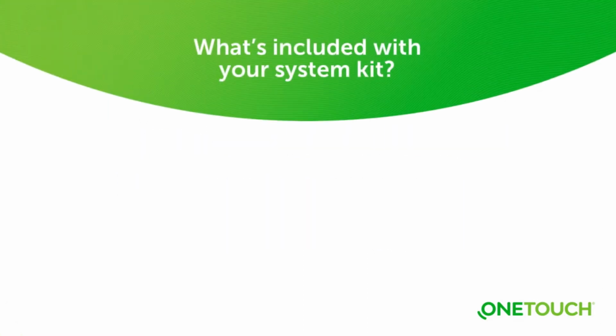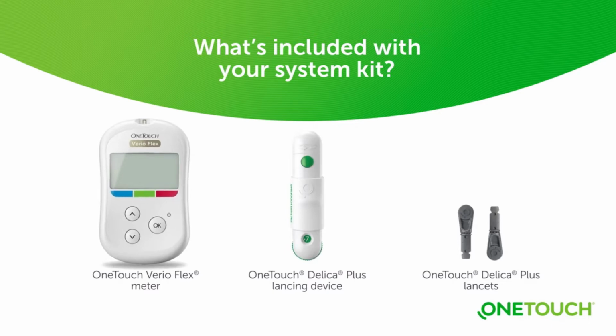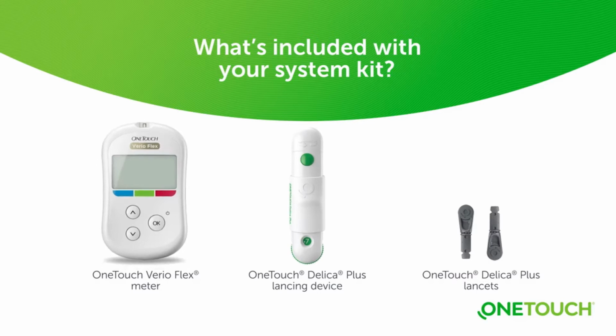First, let's make sure we have everything we need to begin testing. In your OneTouch Verio Flex system kit, there is the meter itself, a OneTouch Delica Plus lancing device, and a packet of OneTouch Delica Plus sterile lancets. OneTouch Verio test strips are required, but may not be included in your kit. Got everything you need together?